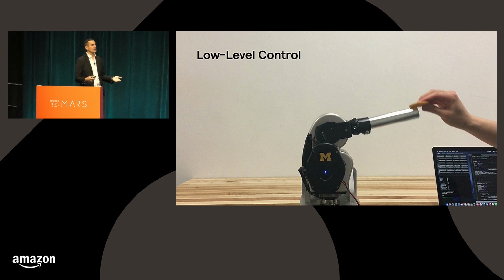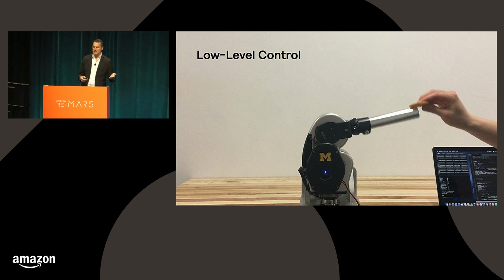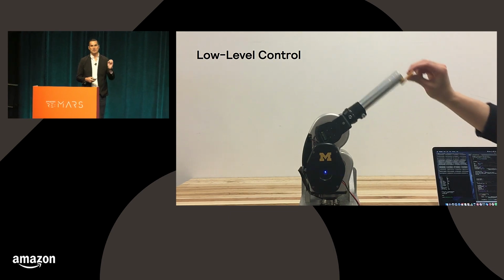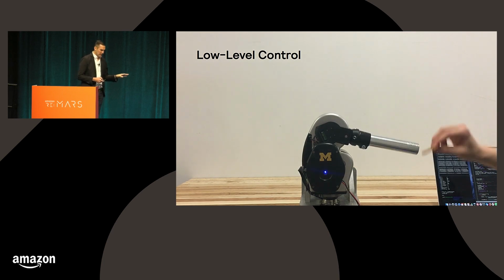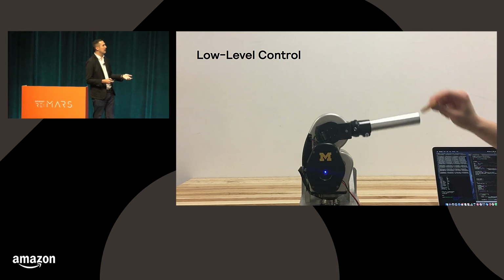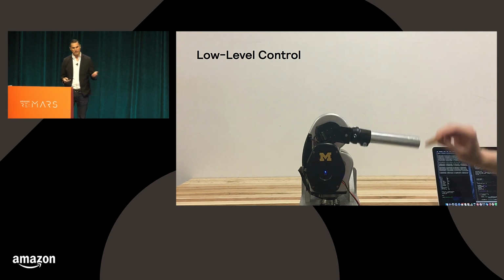We also have quantified the system's ability to track a torque signal or an effort signal. And instead of talking about that in terms of the time domain and frequency domain characteristics, like we talked about for position control, I'll show you the results of a rather intuitive test. So this is a bona fide robotics test where you interact with the system, and it's tracking a reference of 0 torque. So it's supposed to reject everything, the torque associated with its own inertia, the torque associated with friction, and the fact that it can do that without breaking its Ritz cracker means that it has pretty high fidelity torque control.